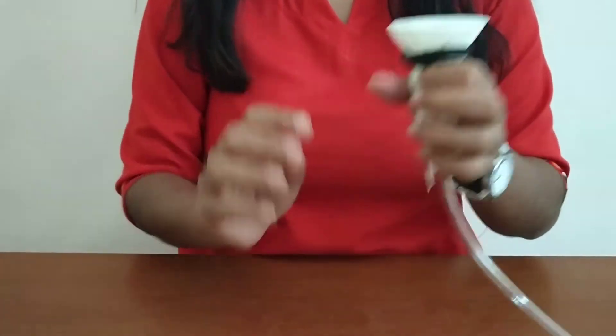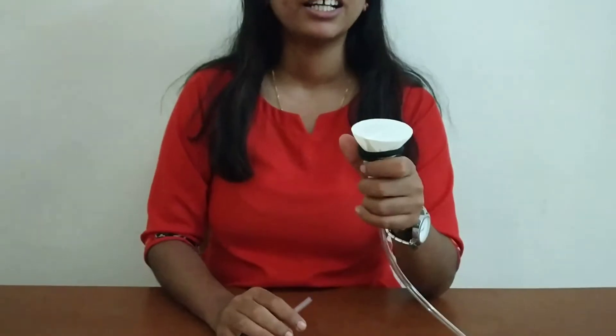Once it is done, your stethoscope is ready. Now you can place the stethoscope near your heart and you can hear your heartbeats.